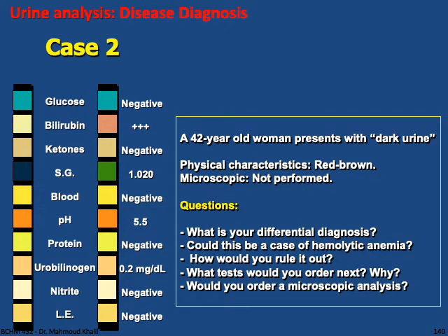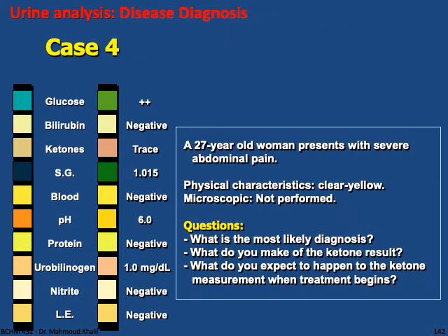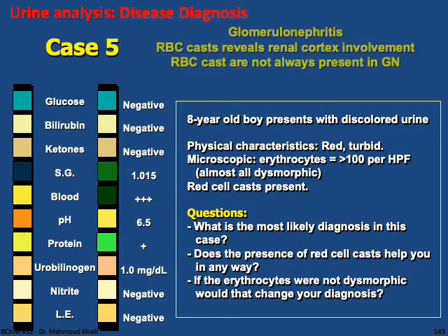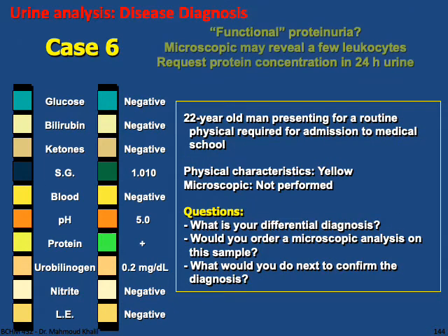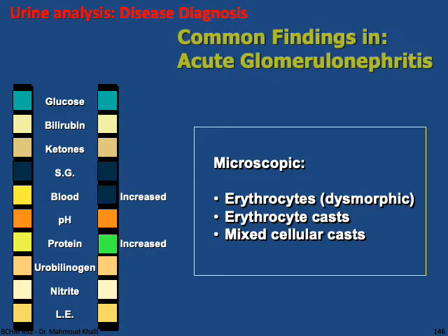In this case, the same. So you need to go through all these cases to understand. You don't need to study or memorize, but to see the effect, the variation in the results of the urine strip analysis, to see how these relate with the type of disease. Again, you don't need to study this slide, but only to understand.